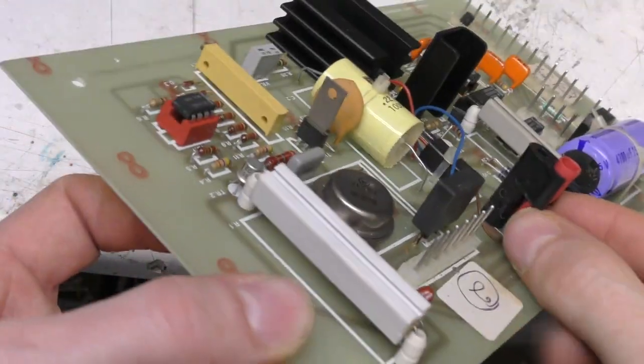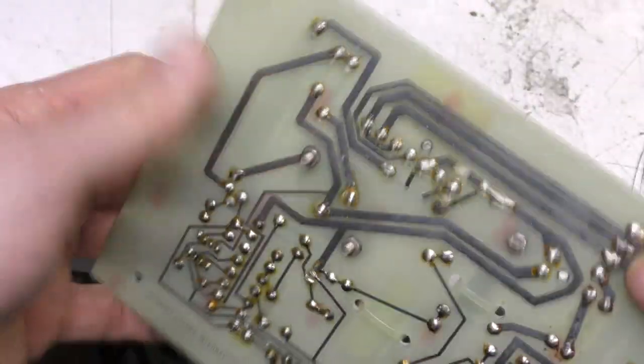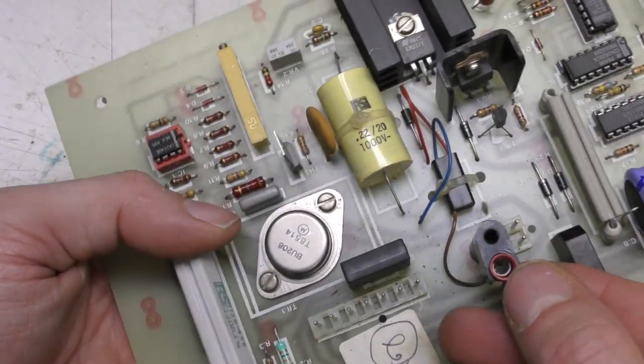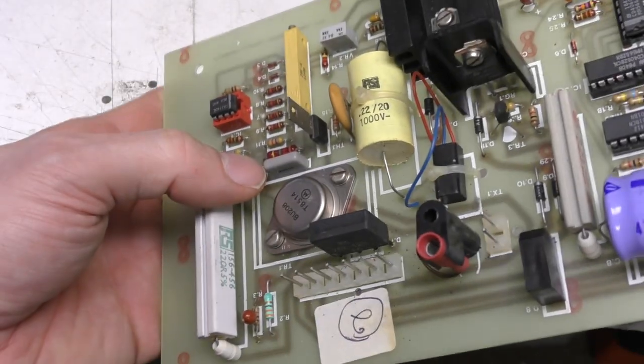So there's this sort of improvised high voltage connection thing. It's just a sort of plastic post that's been stuck on with this connector, which is a bit of a mess. Not really much else on there.